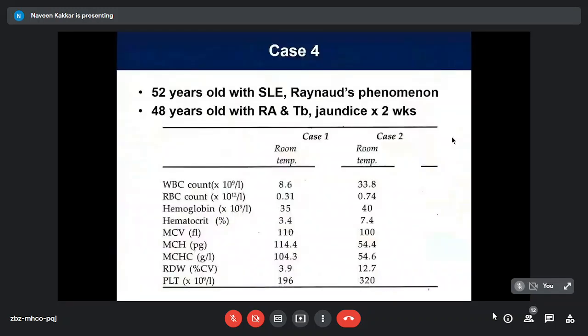Case 4. It's two patients, a 52-year-old with SLE and Raynaud's phenomena, and a patient with rheumatoid arthritis and tuberculosis, jaundice for 2 weeks. So that's case 1 and case 2. And the easier things to notice here are bizarre values. MCV 110, 114, 104. MCV is believable, but MCH and MCHC are not. And RDW less than normal, unheard of. Hematocrit and hemoglobin similar. There's a problem there. RBC count multiplied by 3 should be your hemoglobin. That's not true again.